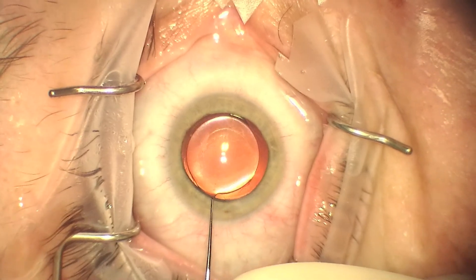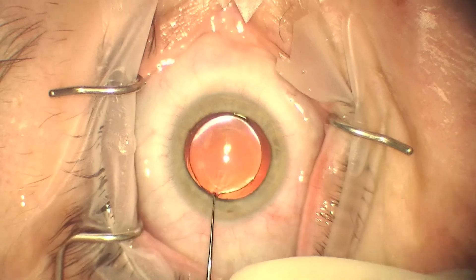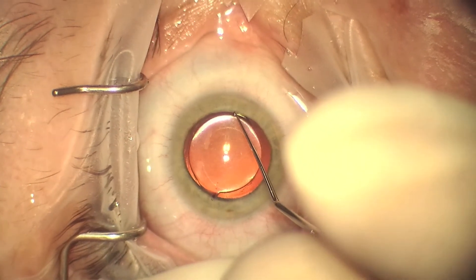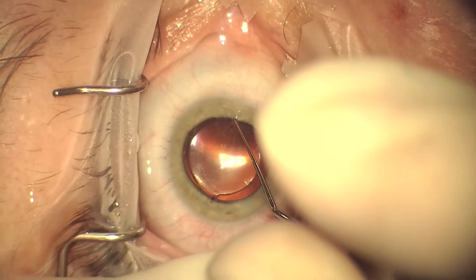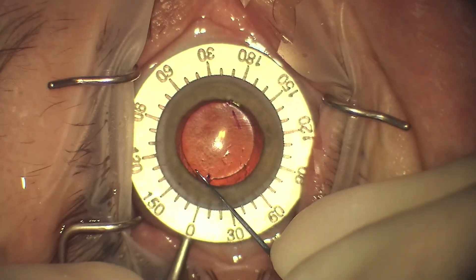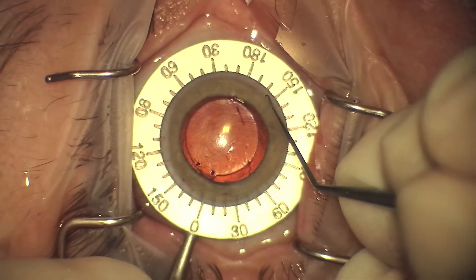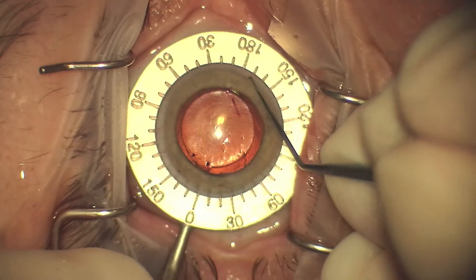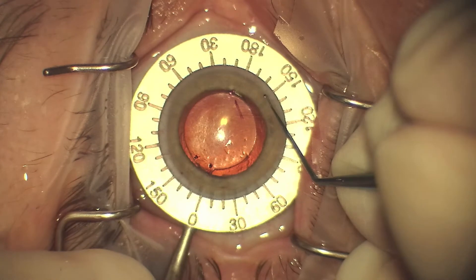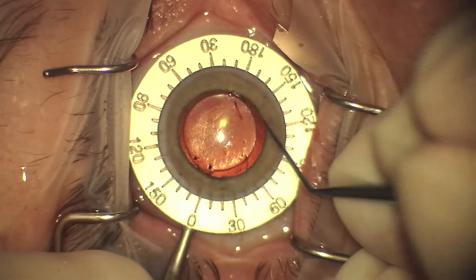We mark the cornea, marking the point where the IOL is currently and where we want to rotate it to. Previously we used our website, www.astigmatismfix.com, which calculated that the IOL should be rotated approximately 30 degrees clockwise. Once we make our initial marks, we find 30 degrees away and mark that precisely.